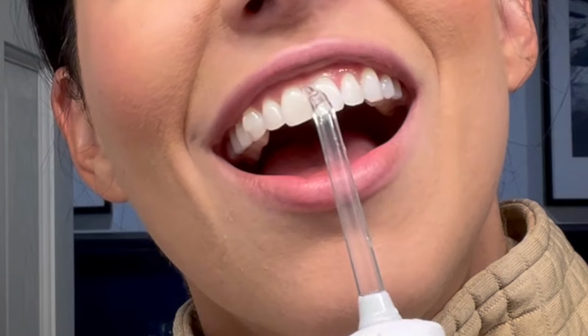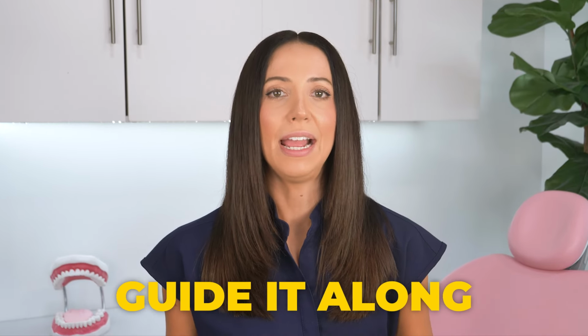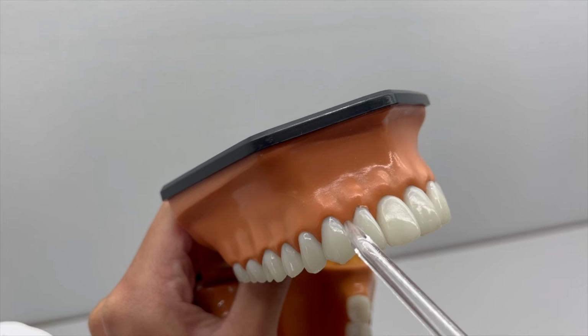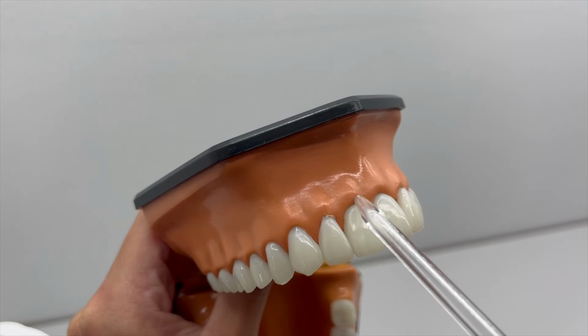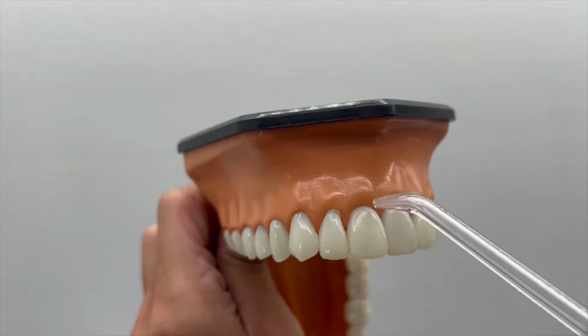Feel where your teeth meet your gums and aim the tip around 90 degrees at the gum line and guide it along from tooth to tooth, pausing for a second between each tooth. So you really want to walk it along the gum line. It's okay to pause for a second in between where you would traditionally use string floss. That's where you can remove lots of debris. And then keep going on to the next tooth. Pause, pause, pause. Pause. It's usually easier for me to start with the back teeth and move forward, and then I do that throughout my whole mouth. Once you're done with the fronts, you're welcome to do all of the backs as well.